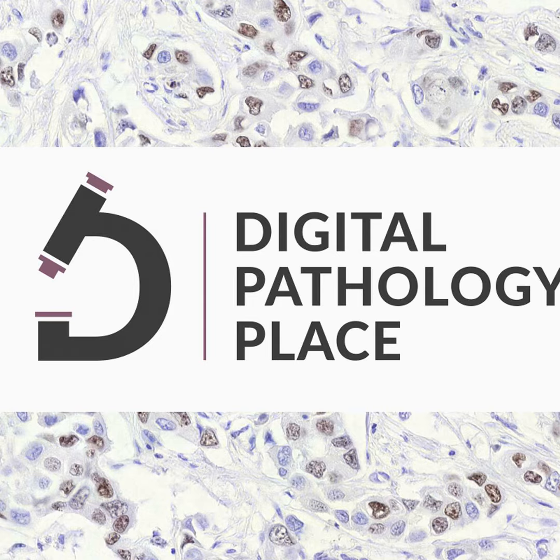So at the ACVP, the American College of Veterinary Pathologists annual meeting, there was a mention, for animal diagnostics for cytology, just one application of cytology, that there is an option to get just AI generated results from the cytology, right? So the veterinarian can submit a sample and get an AI generated result within minutes, and only with additional payment and additional effort will they get pathologist interpretation.